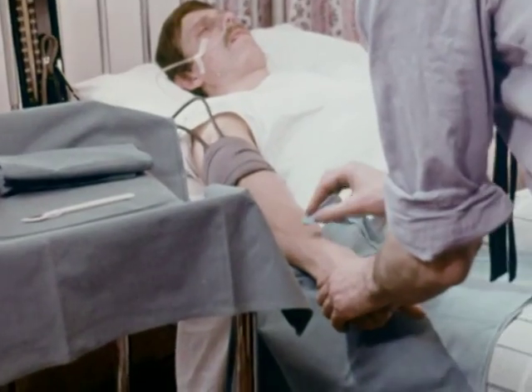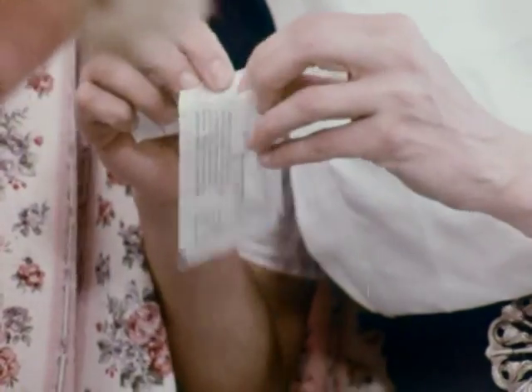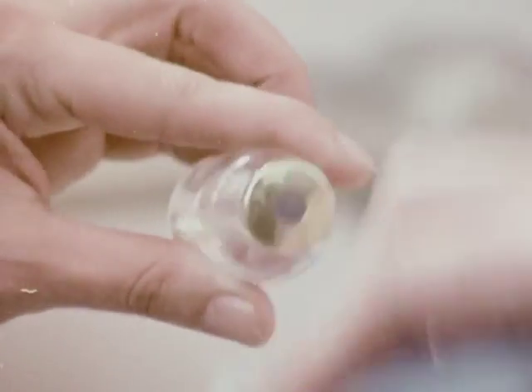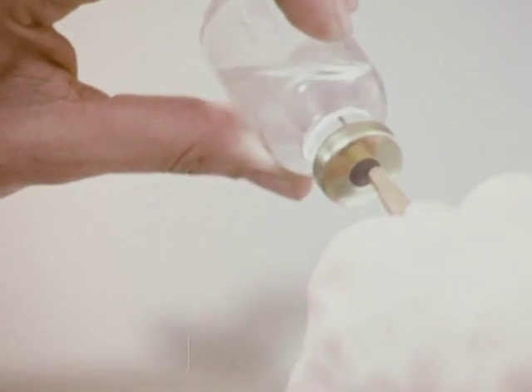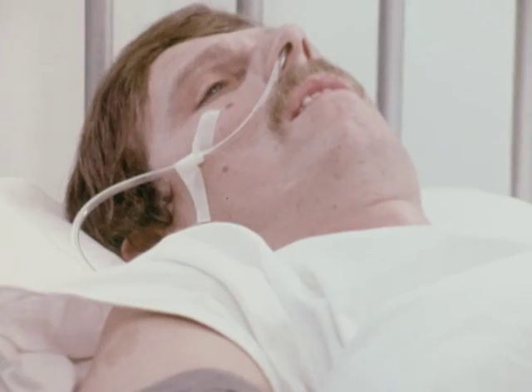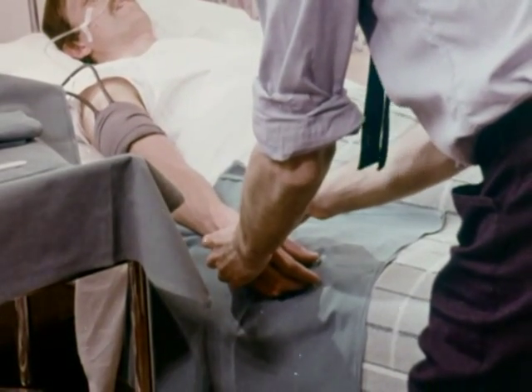When the vein is standing out, the site is swabbed clean. Now, what we're going to do is give you a little local anaesthetic, just so you won't feel anything afterwards. The injection of a local anaesthetic with a very fine gauge needle is obviously kinder to the patient and helps him relax for what to him is an unnerving procedure. Remember, patients are usually conscious during cannulation, and an explanation of what is happening tends to have a calming effect.